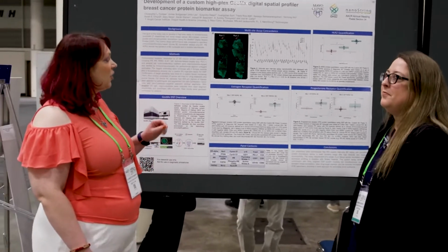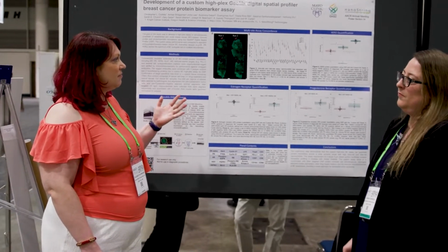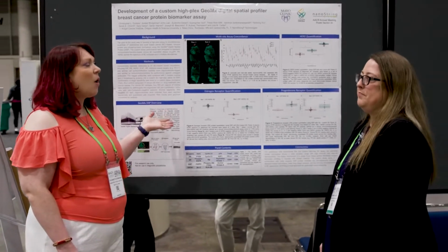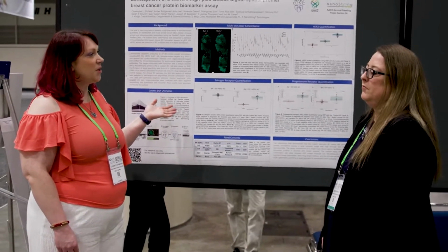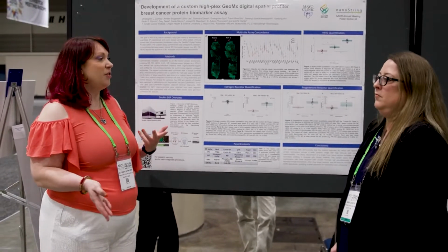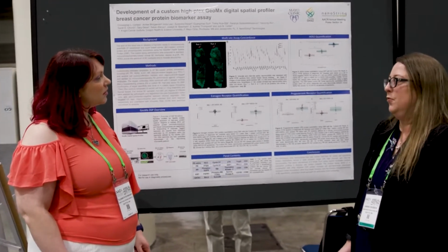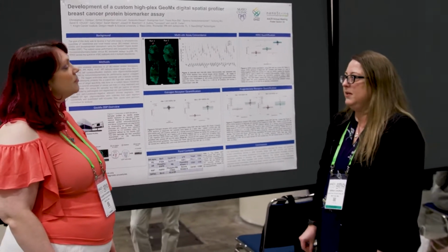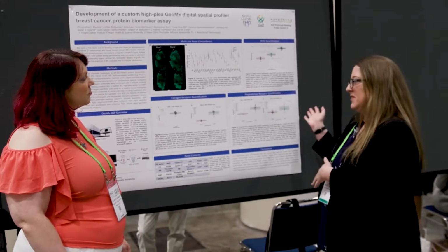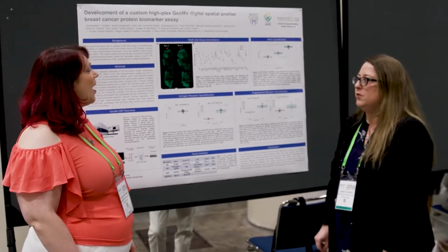Like in the clinical version of this assay, I assume that they're looking at HER2 positive or negative based on IHC already, right? Or are there some instances where they use a bulk gene expression profiling assay to determine whether it's HER2 positive or negative? Yeah, so the FISH assay is also one that's used to look at HER2 positivity. When we're looking at the correlation here, it's based on the IHC, but most of these were also FISH positive. Okay, excellent.